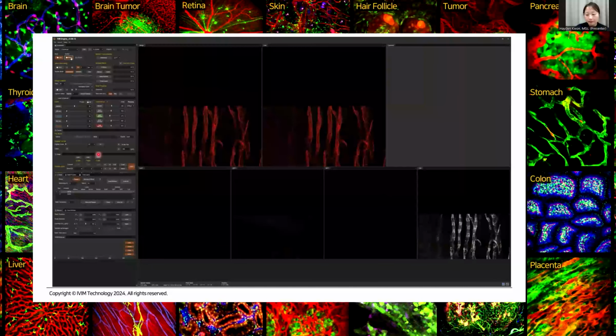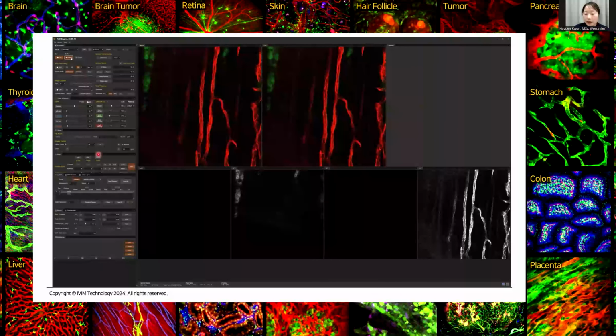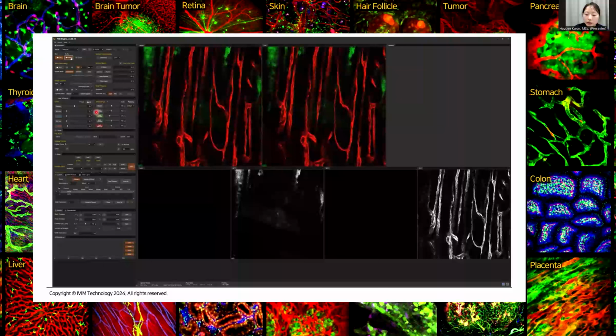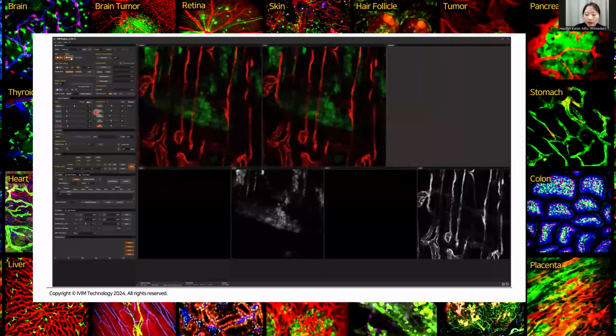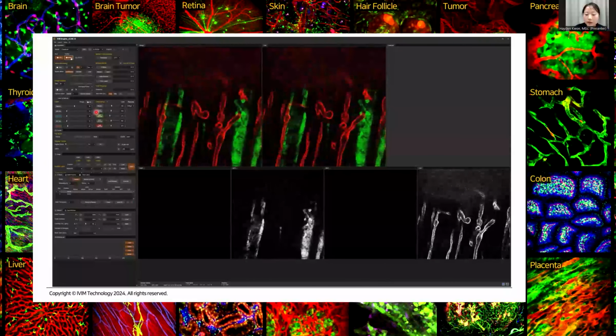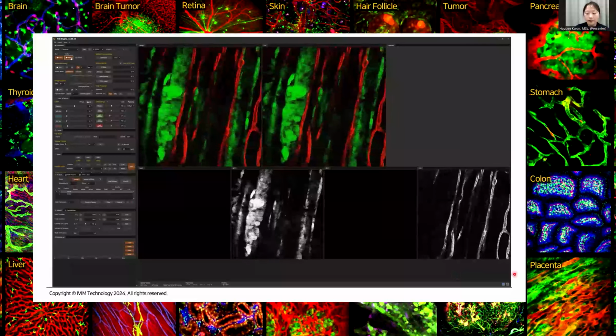To ensure optimal excitation and detection during in vivo imaging, I have already adjusted the laser power and the gain value. By activating the scanner and shutter, we can locate the focal plane until the signals are displayed like this, enabling us to observe the morphology of the tumor cells and blood vessels. Using the jog dial, we can navigate to find the best field of view on the cover glass.